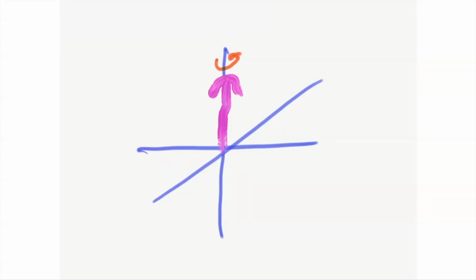You may be familiar with them from your own reading and experience, but these drawings are done in a sort of classical model of physics, in the sense that we're not looking at a single proton, we're looking at the net magnetization of all of the protons that are aligned with the magnetic field. And we know those protons are not stationary, but are precessing around this axis, which represents the long bore of the magnet, or in a sense, the direction of the large magnetic field.